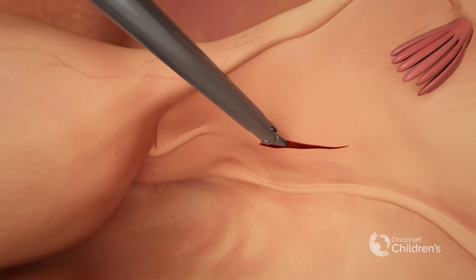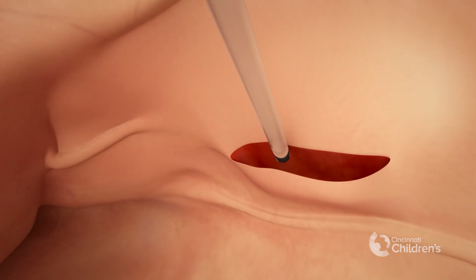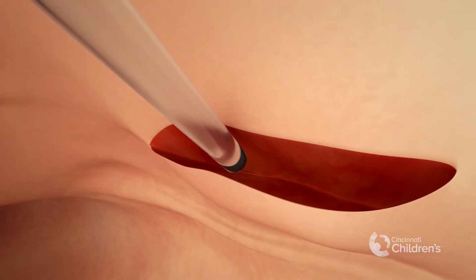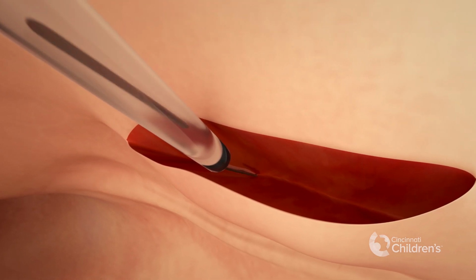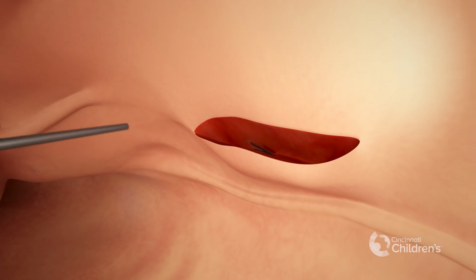In this first technique, scissors are used to make a 2 to 3 centimeter incision in the peritoneum or lining of the abdomen. The thawed ovarian tissue strips are then placed into the space and sealed.